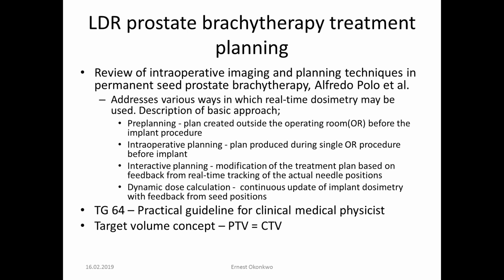The intraoperative plan is produced during a single operating room procedure before implants. Then you have the interactive planning, which is a modification of the treatment plan based on feedback from real-time tracking of the actual needle positions, because when the urologist is piercing the needles into the prostate, of course the prostate is moving. So with that movement, you have to take that movement and deformation of the prostate into account.